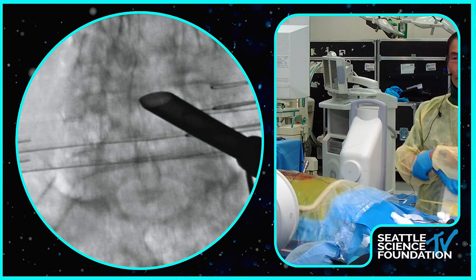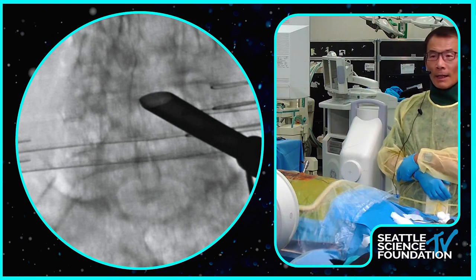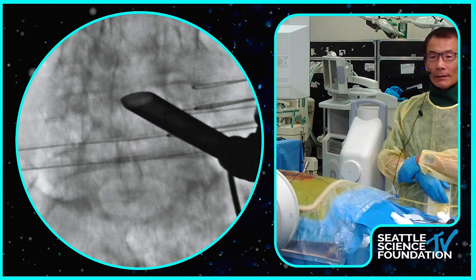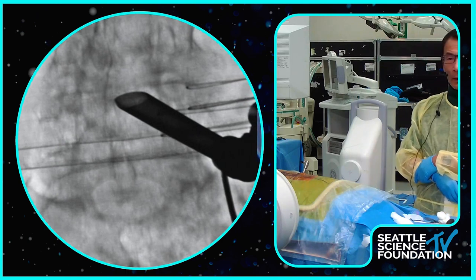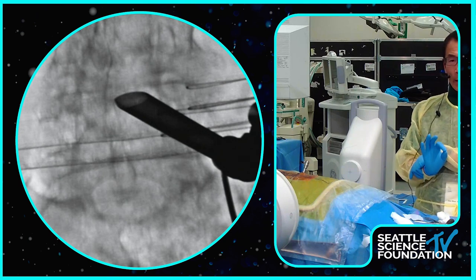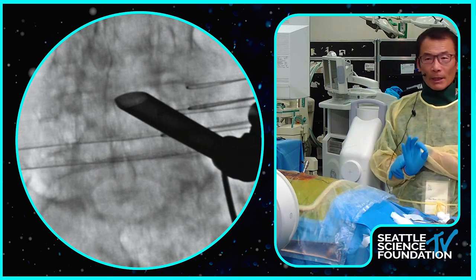You can see the big needle on your right hand side, that's right lateral to the S1 pedicle. Okay, there we go. Right lateral to the S1 pedicle. Nice. And then I put my dilation in your regular interlaminar approach.